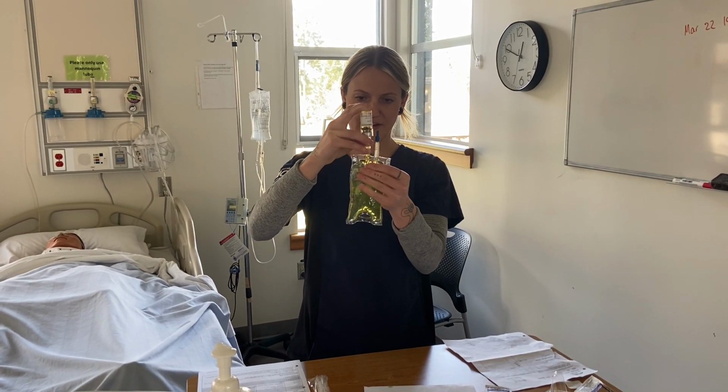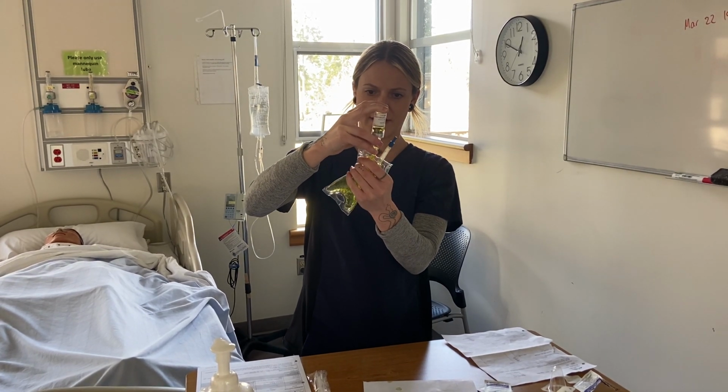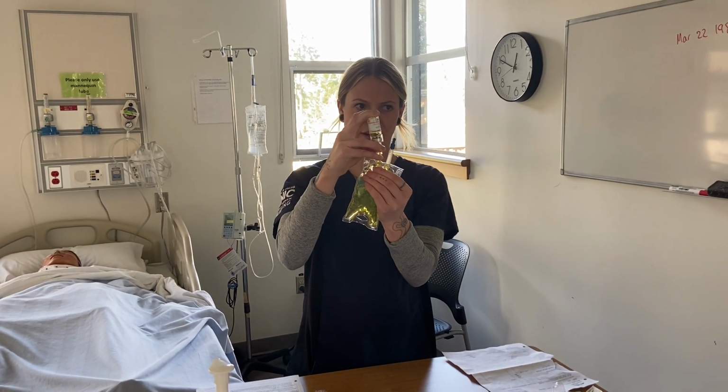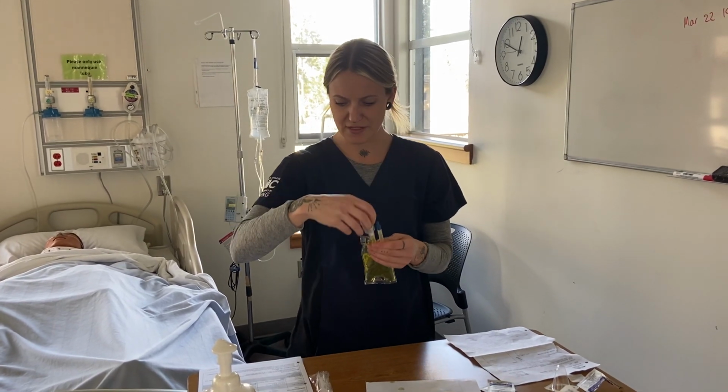I didn't leave a big enough air bubble, so it's not really going in properly. And in real life, I would never leave any medication left in the vial, but just for the video's sake, I'm going to just go with that.